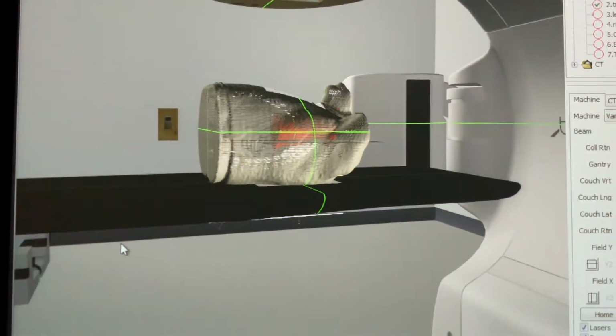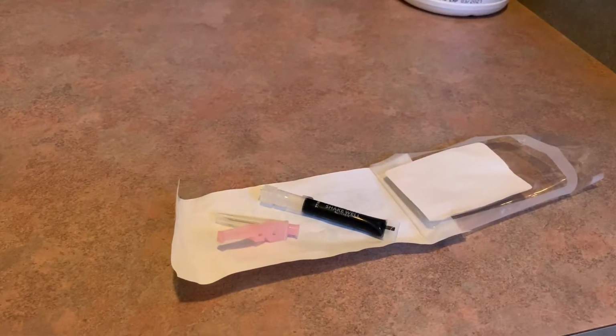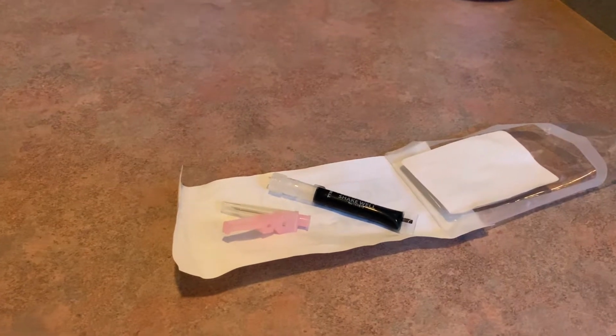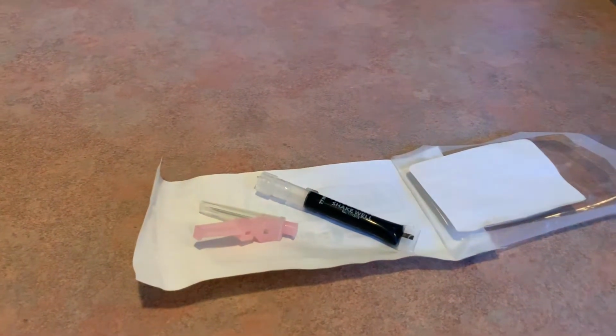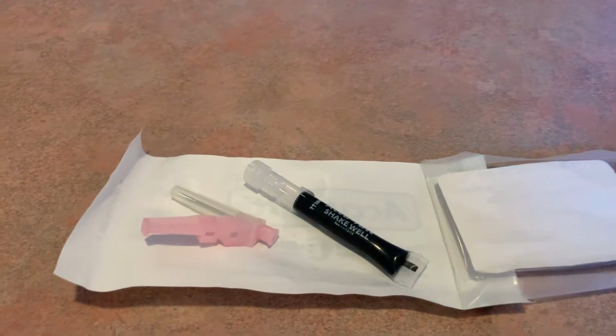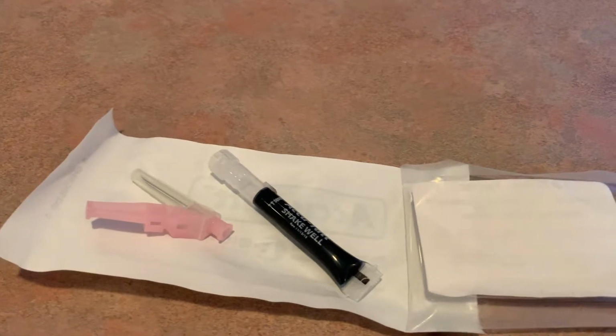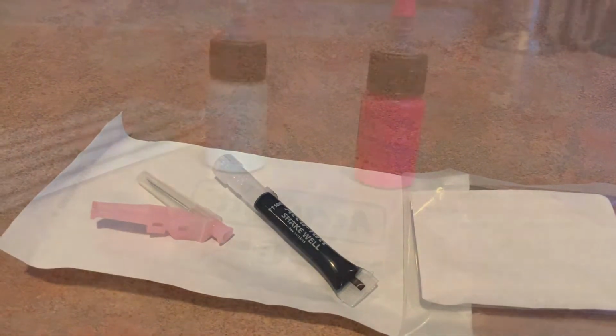The typical tattoo marks used for radiation therapy are made with black ink and placed just under the surface of the skin using a needle. You may feel a slight poke as the therapist gives you these tattoos. These tattoos are very small and you may not even notice them when you're looking for them. However, know that the therapy team is able to find these marks.